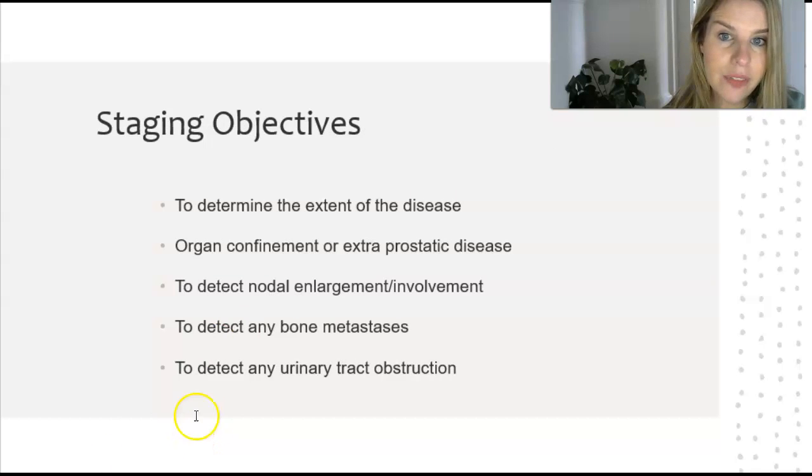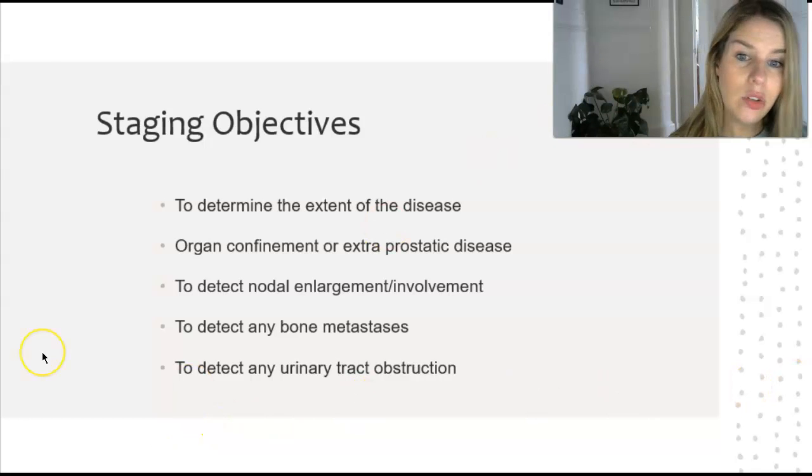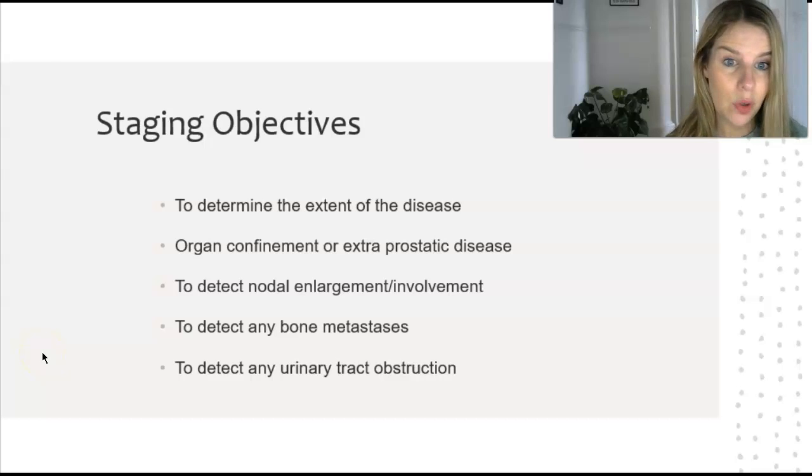And really, part of the staging is to determine the extent of the disease, and also to ascertain, is the tumour confined to the prostate, or is there actually tumour extending out of the prostate, so extra prostatic disease.